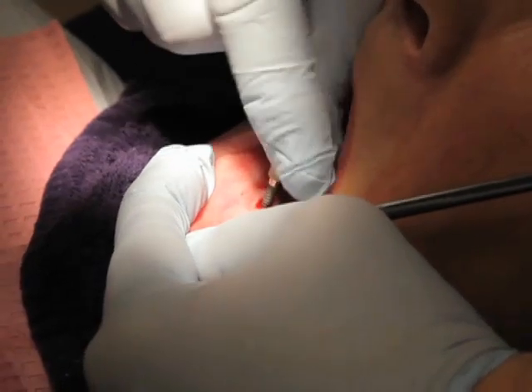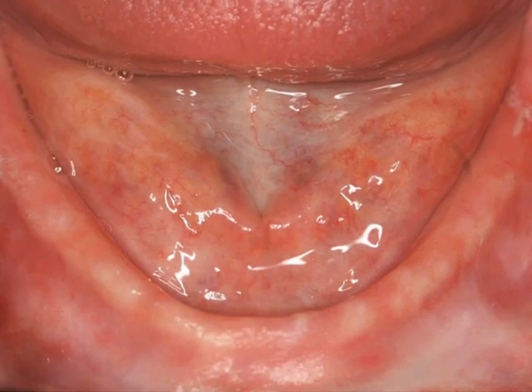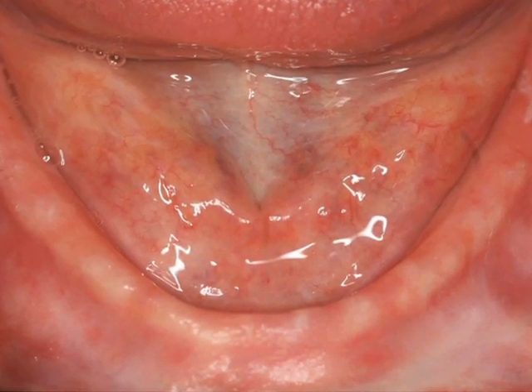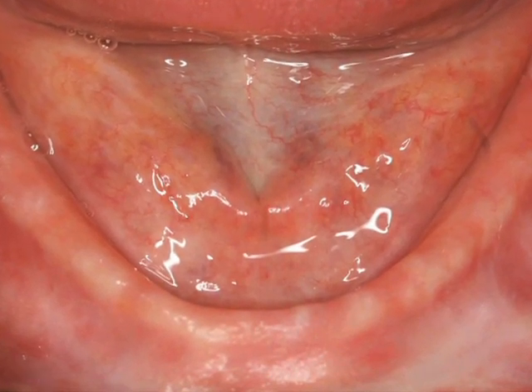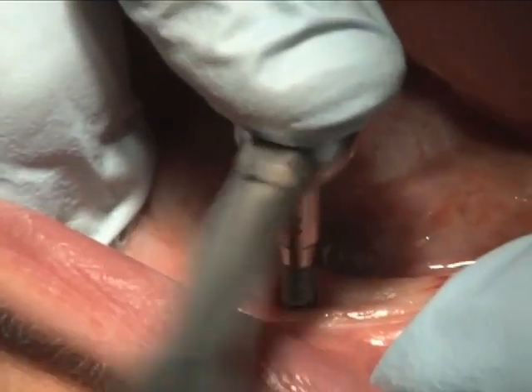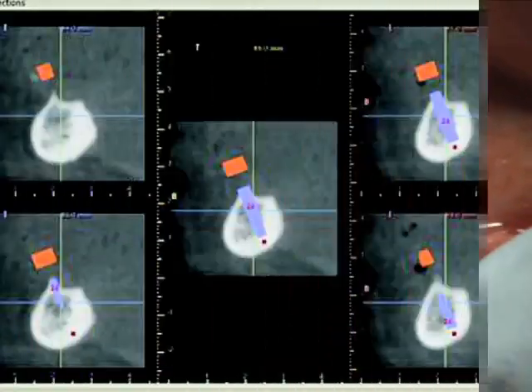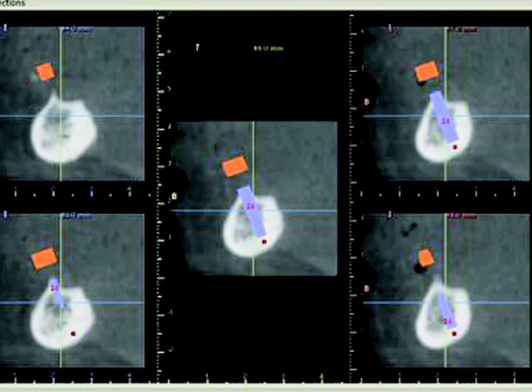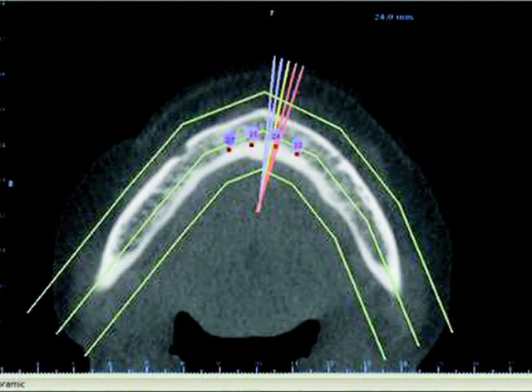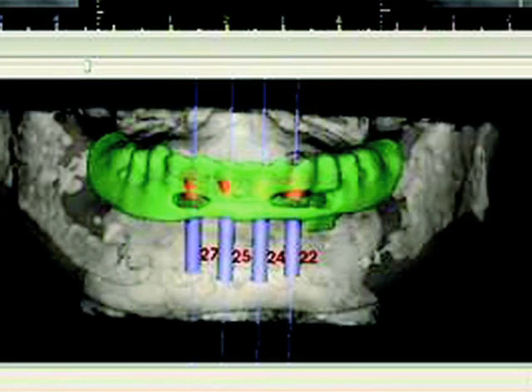However, we sometimes are presented with challenges relating to bone quality or quantity, anatomic restraints, and aesthetic complications. The therapeutic goal of implant dentistry is simply oral rehabilitation and improved form and function. When we include dental implants in our diagnostic armamentarium, we provide patients with hope for long-term positive results. Modern technology and design enables us to surgically place implants in compromised areas.